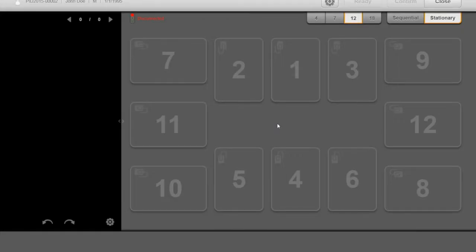After checking the patient's information, you will see the main window of RIOView. The desktop is where images are displayed when they are being viewed or captured from an external source. This is the sensor indicator. It provides the connection information of the sensor at all times. This is your teeth selection tab.